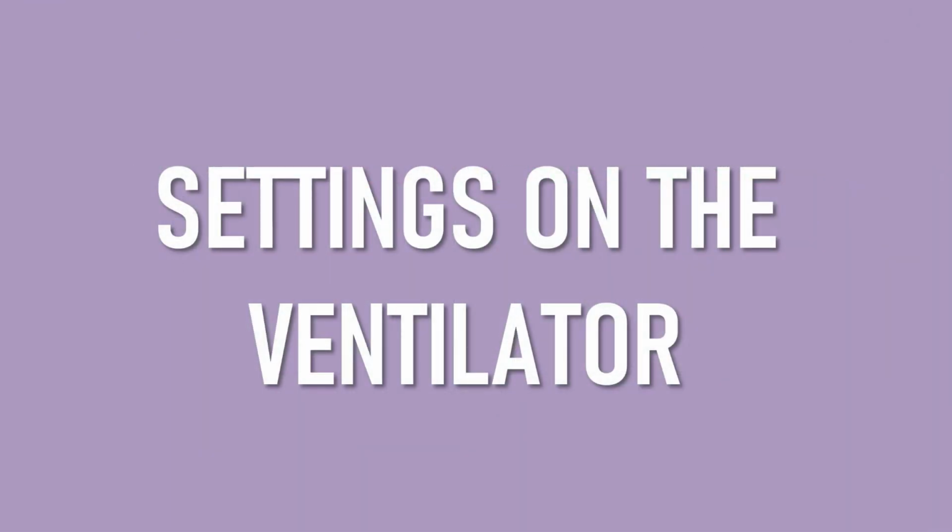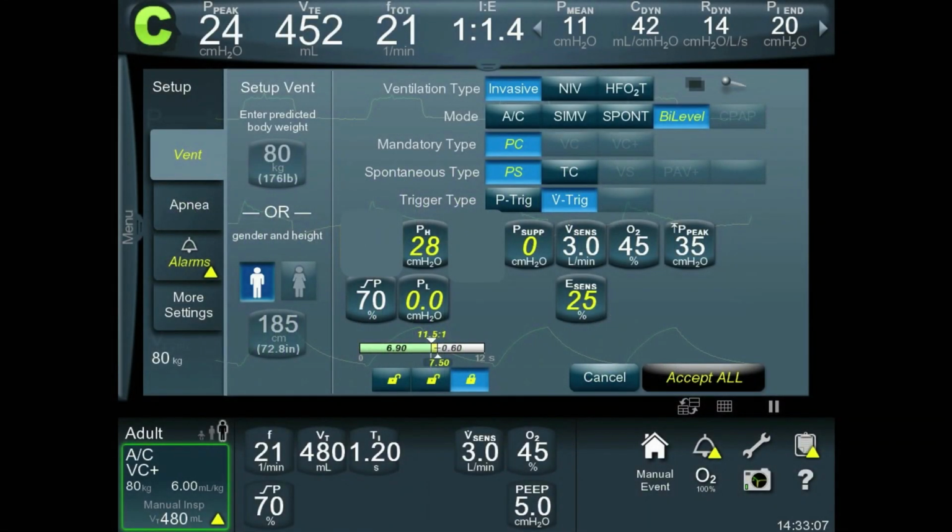What about the settings on the ventilator? So let's have a look at the different settings on the ventilator to put a patient on airway pressure release ventilation. First of all, we use bilevel. Now you can use pressure control if your patient is paralyzed, but it's so much easier to use the mode of ventilation for which this has been used for many years now. The spontaneous breath you can set at either tube compensation or pressure support. Normally this will only be on the low pressure level, and you're using airway pressure release ventilation. To me, it makes no sense to have any pressure support at any stage. So my inclination here would be normally to turn this off or just put the patient on tube compensation.